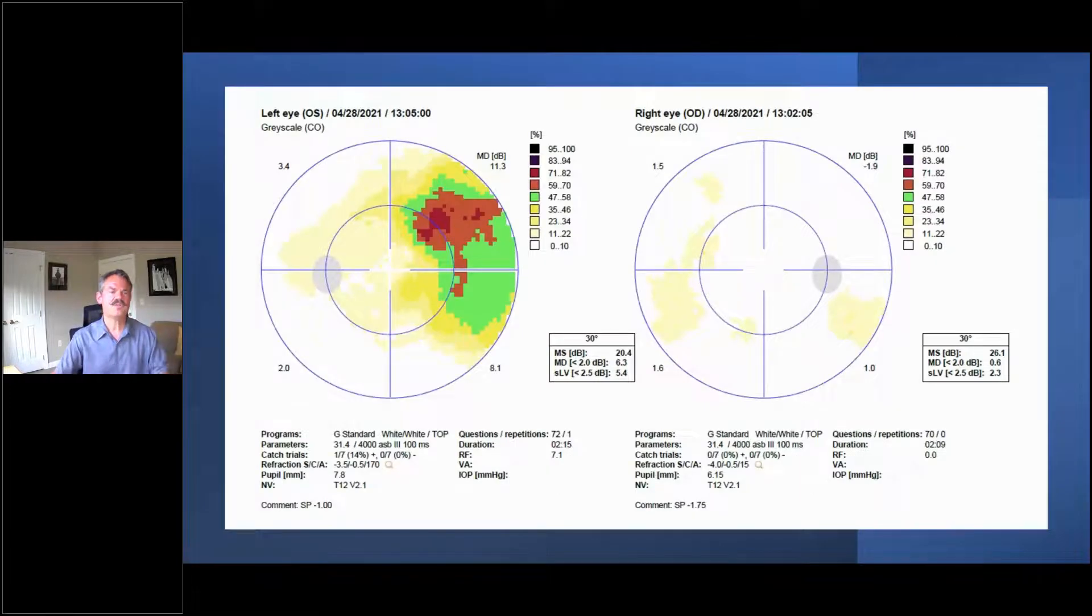As we look at the visual field, this is an Octopus visual field. The right eye is barely registering some scattered defects. But the left eye has an arcuate scotoma here that according to HAP criteria we would grade in the moderate range.